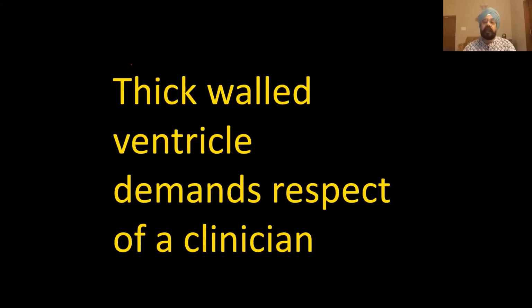Now, the mitral valve leaflets are elongated, chordae are elongated. I am adding chorda. Dr. Murugan has asked me how the mitral valve leaflets are elongated. How do you say, by measurement? So one is a common term. In diastole, if the AML exceeds 20 millimeter, it is elongated. But more than 25 is almost certainly elongated.